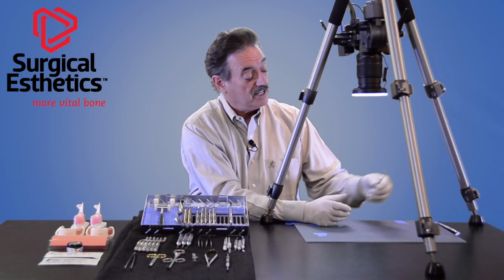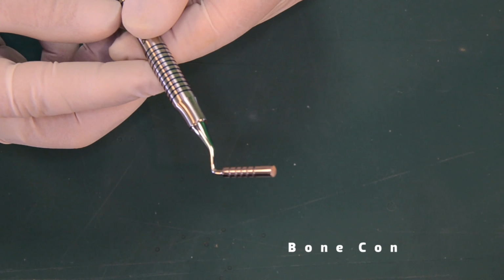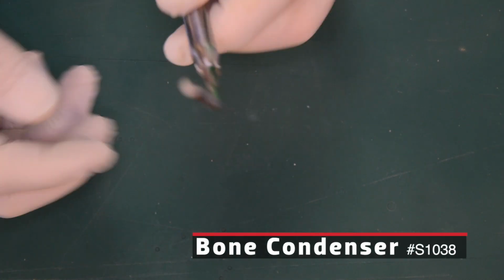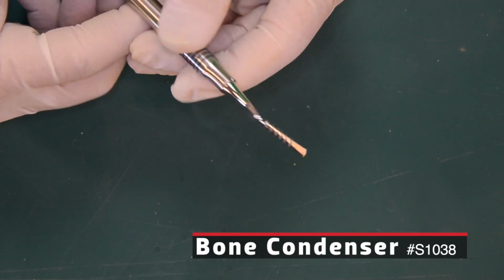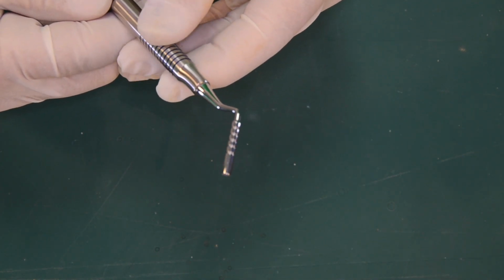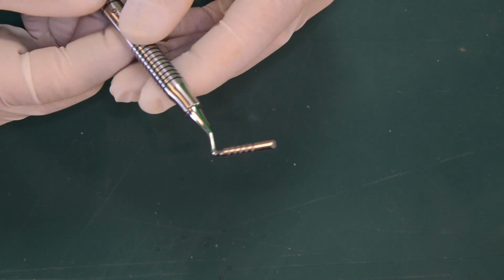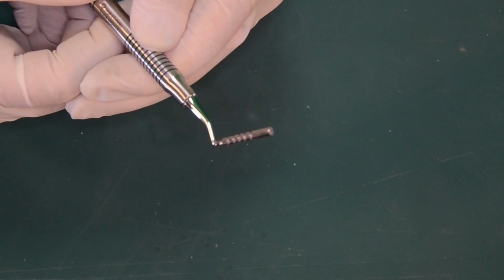in a socket. And then we have your traditional shaped condenser, which again works well, but we want to reiterate that again, you're not condensing bone graft material like you are an amalgam, you're really just lightly condensing it. You still want to see that blood flowing, sucking up into your graft material.